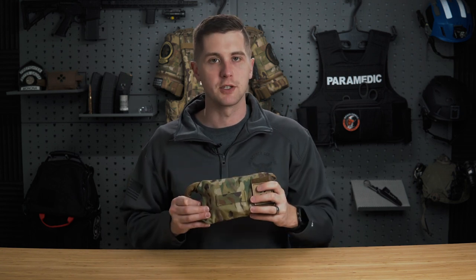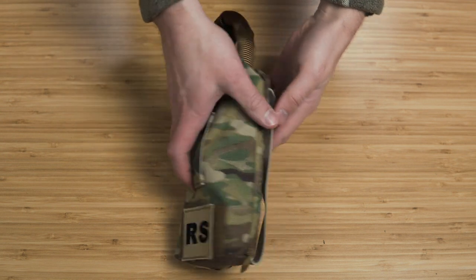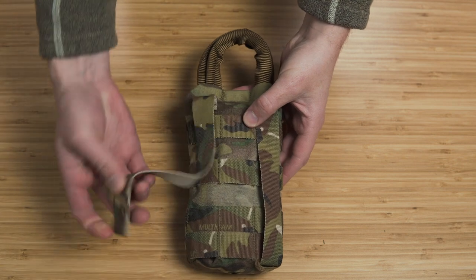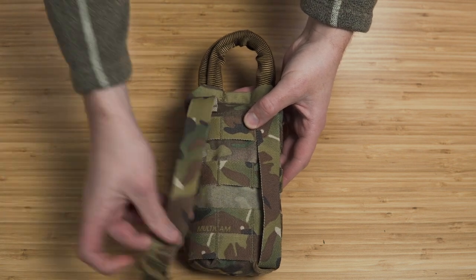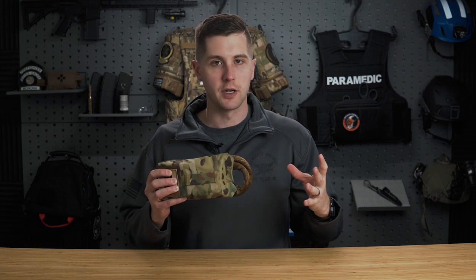I'm actually super excited to review this product because I saw it on Instagram, was instantly intrigued, and then there must have been some kind of telekinetic phenomenon going on because they actually reached out to me and asked if I wanted to take a look at it. I think this is one of the coolest items on the market for moving people in austere, stressful environments.